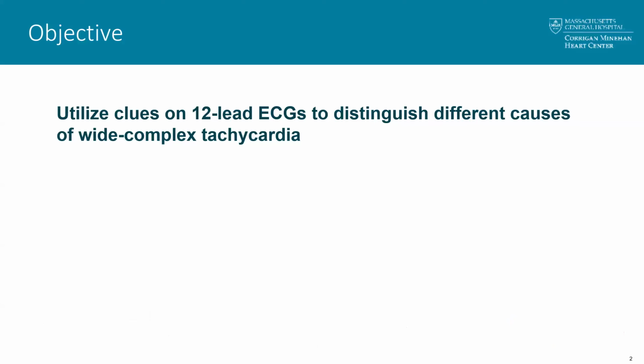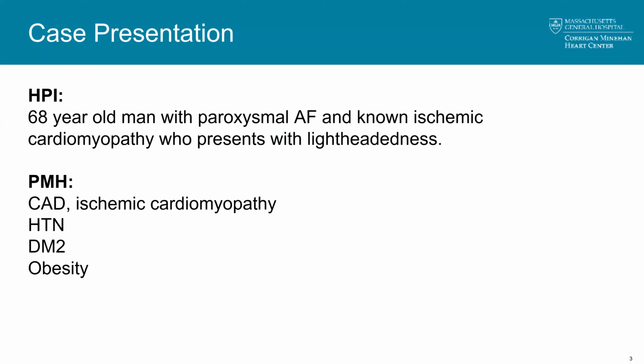And so the objective for today's session is just the following. I'm hopeful that at the end of the session, participants will be able to utilize clues on 12-lead ECGs to distinguish between the different possible causes of a wide complex tachycardia and to recognize the challenges associated with the evaluation. So the patient we'll be talking about is the following.